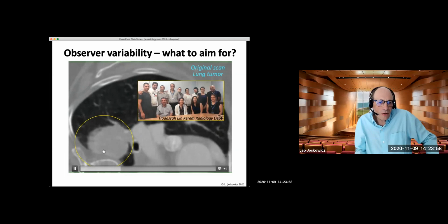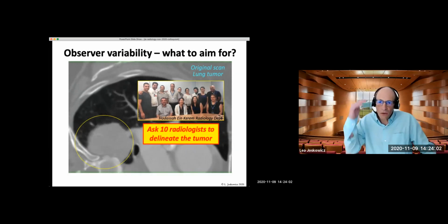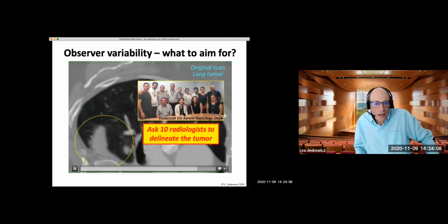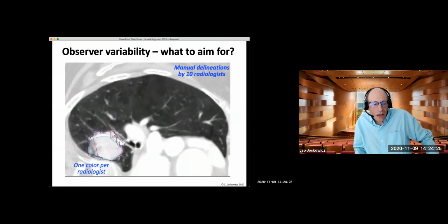What I'm showing you here is the same tumor, looking at the axial slices on a CT. And this is the team of the radiology department headed by Professor Sosna at the Hadassah Ein-Kerem Hospital. We asked these 10 people, both experienced and not experienced, to delineate the tumor. Tell us where is the boundary of the tumor. And this is the result.